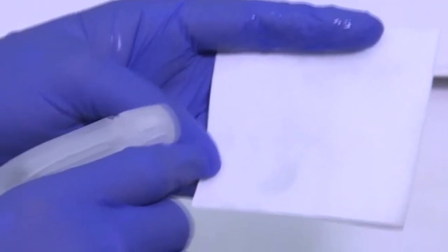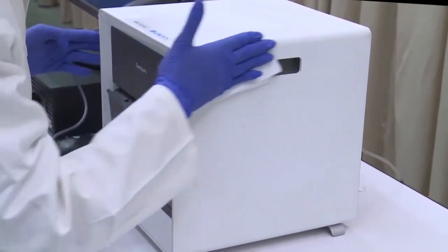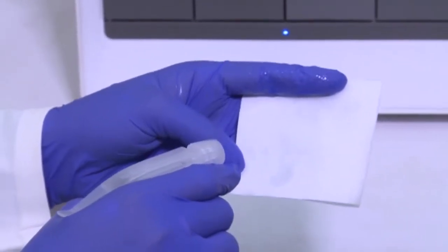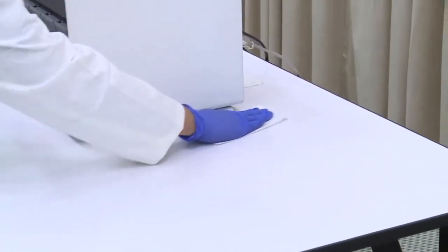First, we will demonstrate the monthly maintenance first procedure of how to clean the instrument surface. Firstly, moisten a lint-free paper towel with 70% ethanol solution. Wipe the instrument surfaces thoroughly with the paper towel. Then take a new lint-free paper towel, moisten it with 70% ethanol solution, and clean the table area around the machine.